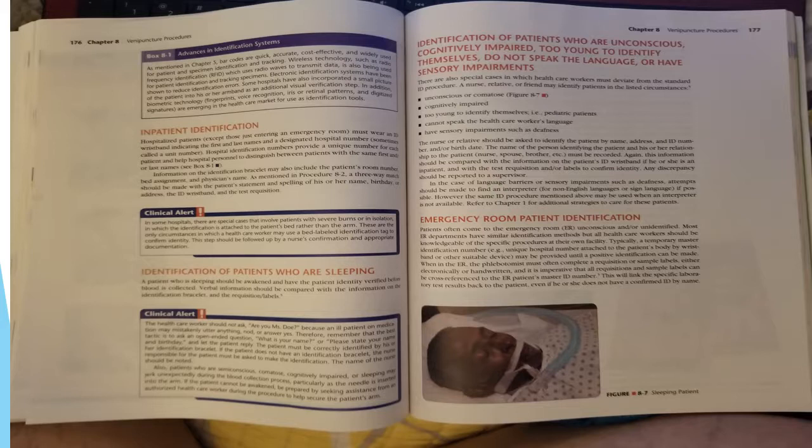Identification of patients who are sleeping. A patient who is sleeping should be awakened and have the patient identity verified before blood is collected. Verbal information should be compared with the information on the identification bracelet and the requisition labels. Clinical alert. The healthcare worker should not ask, "Are you Mrs. Doe?" because an ill patient on medications may mistakenly utter anything, nod, or answer yes. Therefore, remember that the best tactic is to ask an open-ended question: What is your name? Or please state your name and birthday, and let the patient reply.